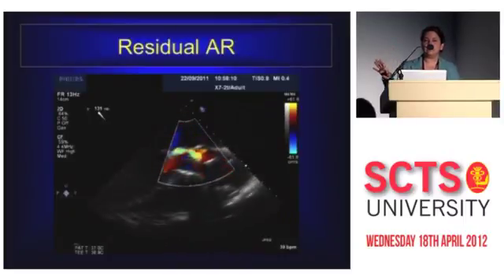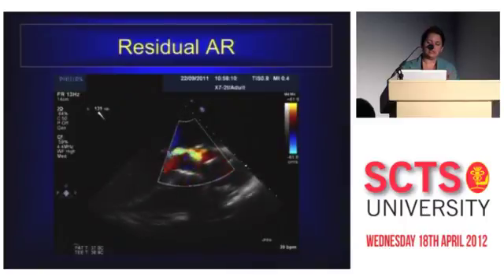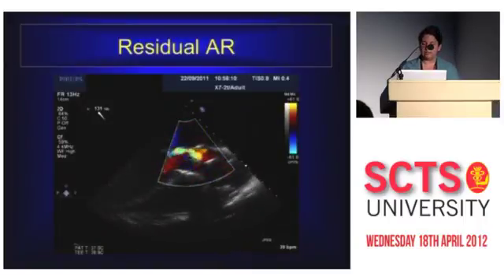But if the hemodynamics, just like surgeons and anaesthetists talk sometimes, after repairs and valve procedures, when you want to actually check for regurgitant jets like this, you have to get the hemodynamics ideal. So if the patient is underfilled, you have to fill them up. If the blood pressure is low, you actually have to increase the blood pressure, otherwise your assessments are going to be invalid. So once you're happy with the hemodynamic status, you do look for AR.